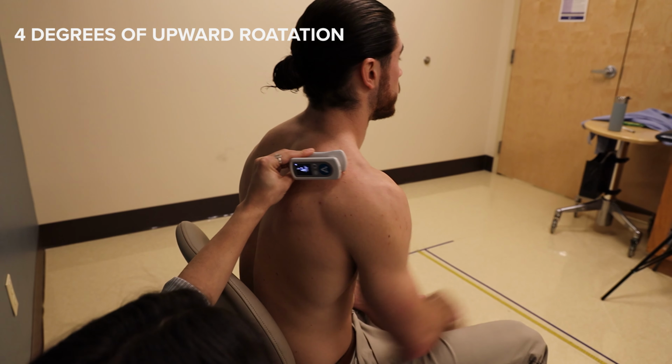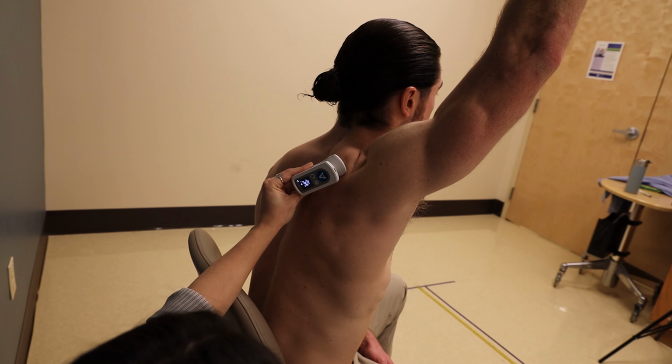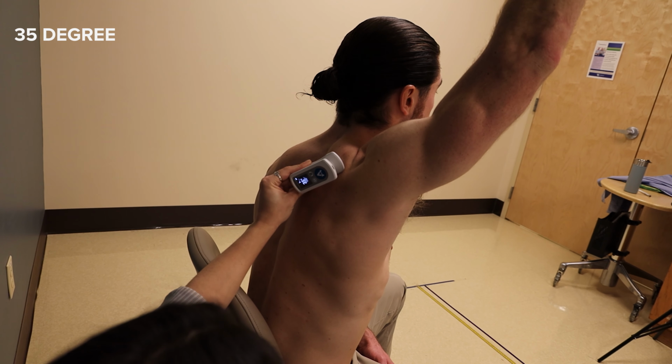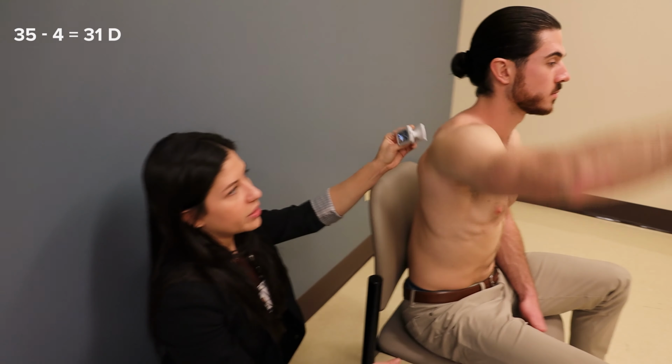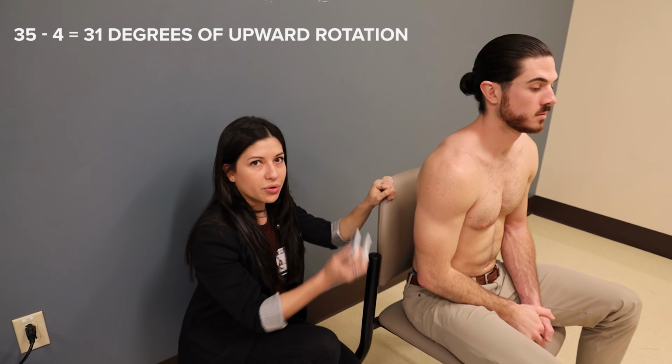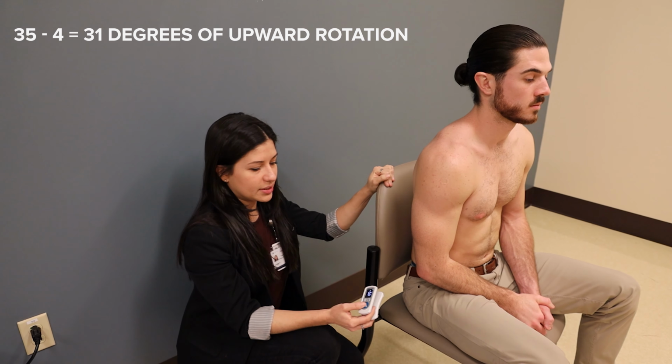So go ahead and elevate your arm as high as you can. Good, now he's at 35 degrees. So 35 minus 4 is 31. So his scapula upwardly rotated 31 degrees.